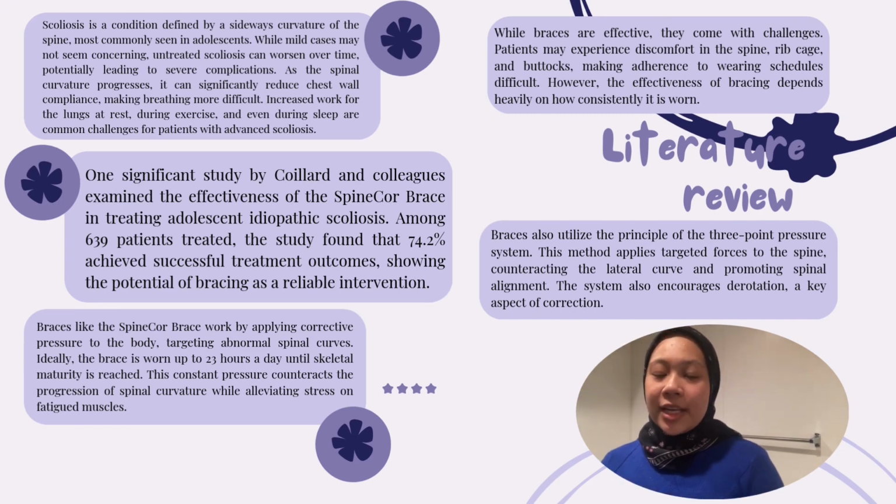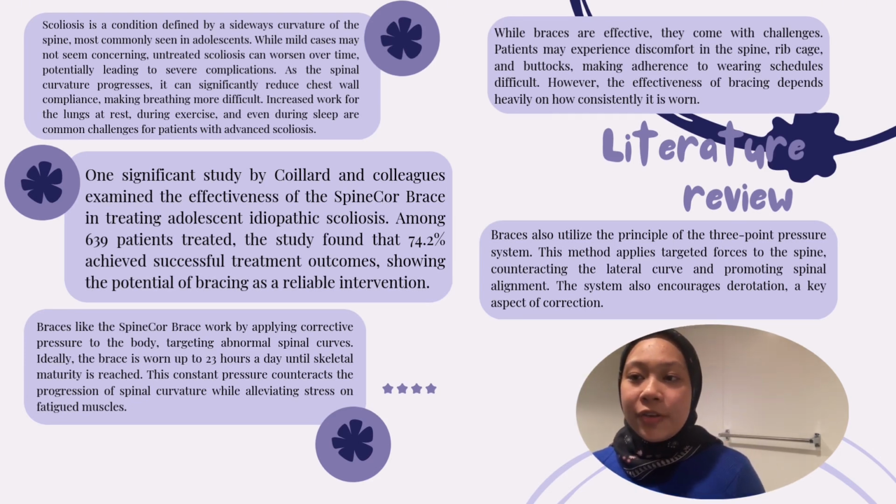While braces are effective, they come with challenges. Patients may experience discomfort in the spine, rib cage, and buttocks, making adherence to the wearing schedule difficult.